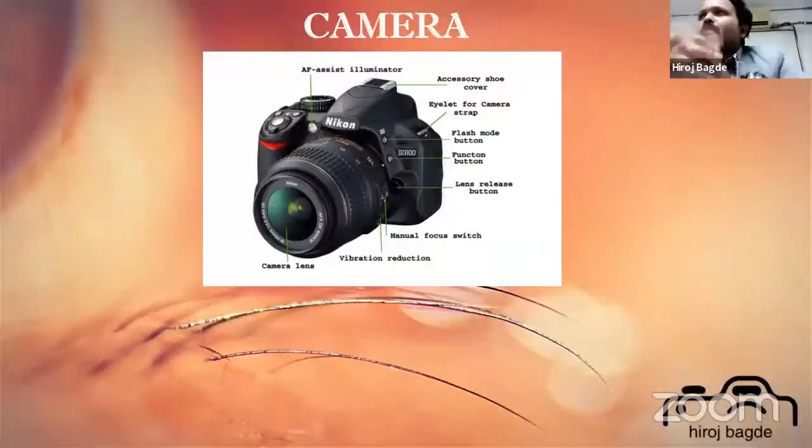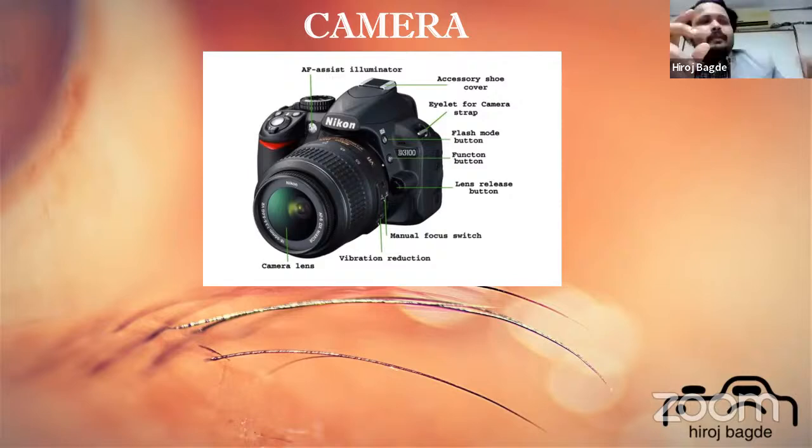Now, first of all, everybody knows what a DSLR is nowadays. It's very common. Every household will have this. But the problem is, why carry such a big device for a simple purpose of recording a case? Now, why are we recording a case? It's not just for medical legal purposes, but we need to identify and rectify the mistakes which we have made, by these macro lenses.